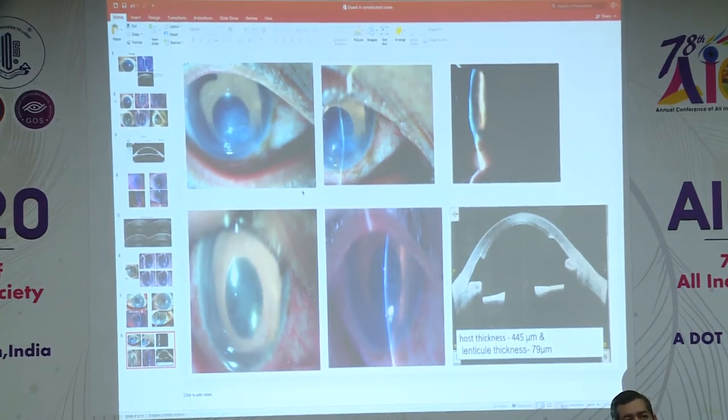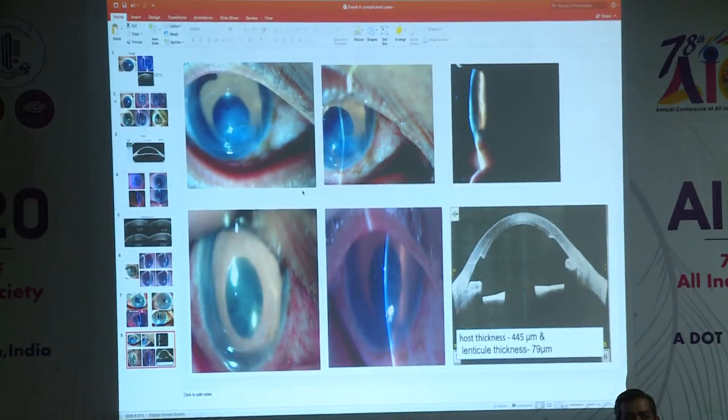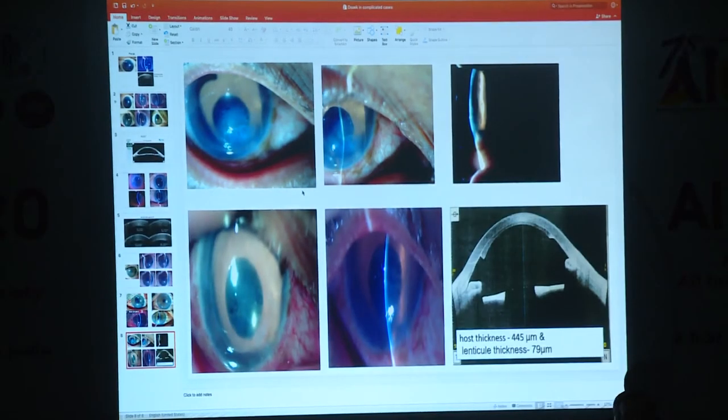Any tip for doing a DSEK if ACIOL is in there? I have done quite a few with the ACIOL in. Now it depends whether you have vitreous accompanying the ACIOL or not and how well the ACIOL is positioned. If the ACIOL is nicely positioned, no vitreous, I go with the conventional DSEK like this and they have done very well. But if there is vitreous, or the IOL is not properly placed, then I would remove that IOL and go with the retrofixated IOL the way I showed you. I do a vitrectomy and then I go with the retrofixated IOL and then I do a DSEK with that.